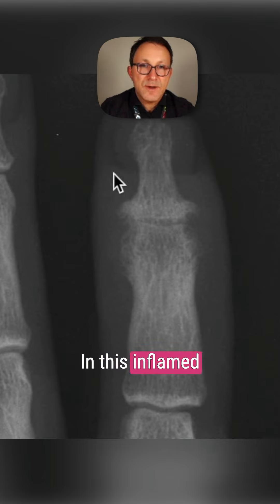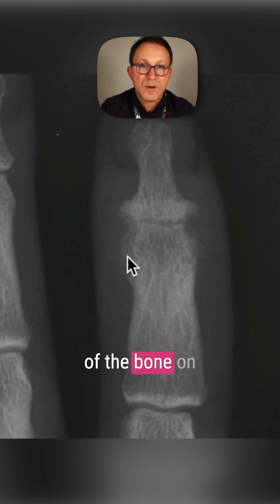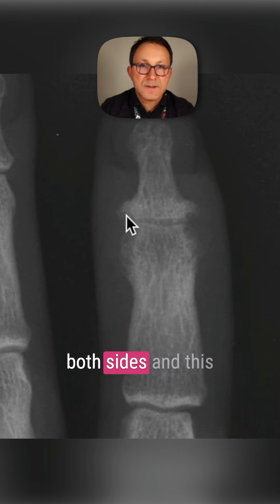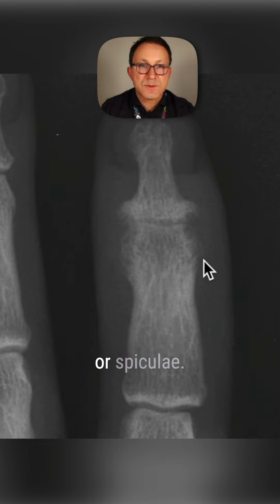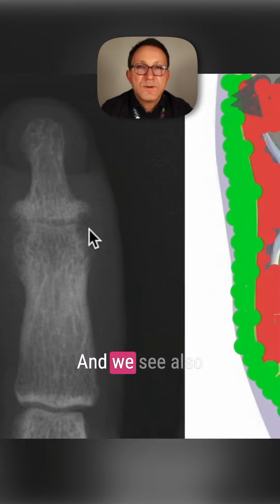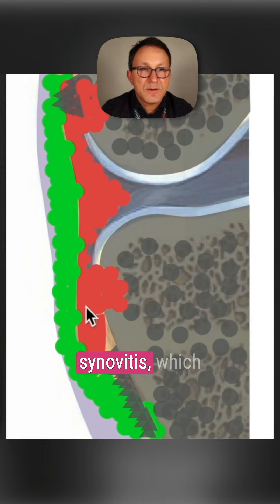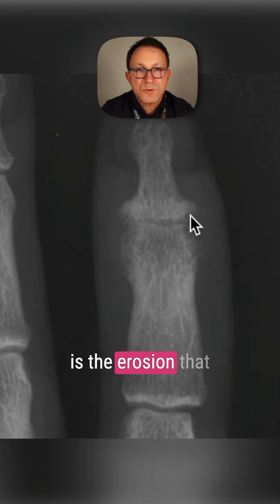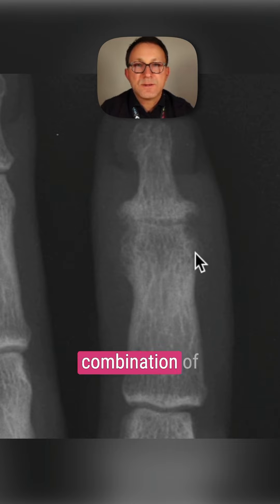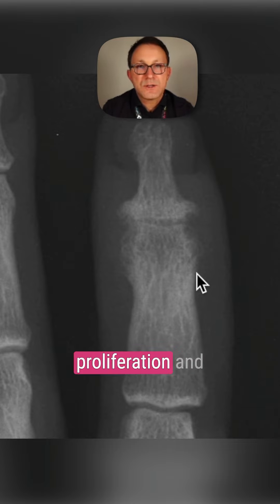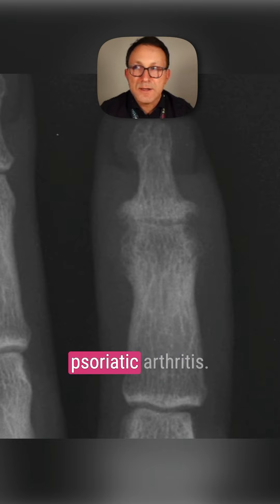In this inflamed joint, we see there is irregular contour of the bone on both sides, and this is called periosteal reactions, or spiculae. We see also the destruction of the bone due to the synovitis, which is the erosion that we see on the marginal position. So we have this combination of proliferation and destruction, which is very typical for psoriatic arthritis.